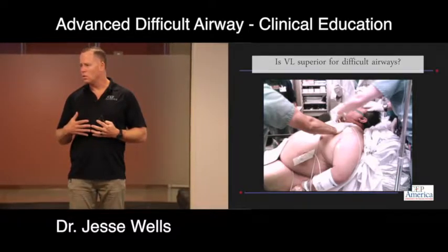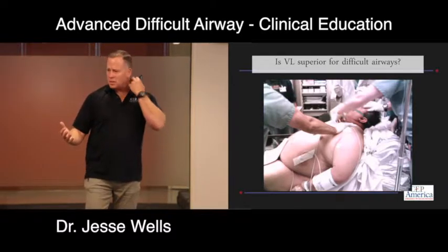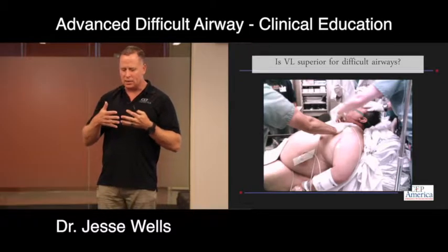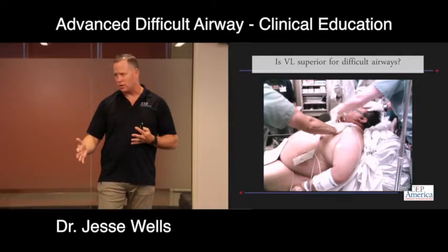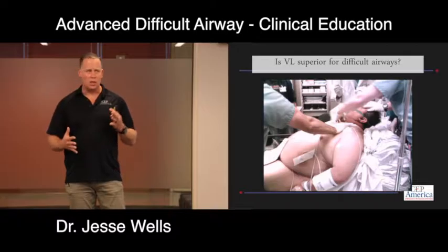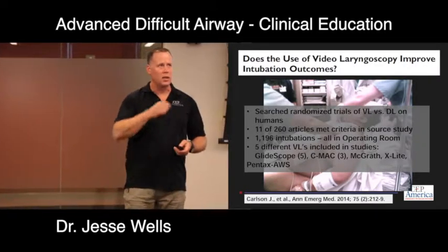What does it mean? It means that probably when they did the study, the people using the video weren't fast at what they had. Right. So what this means is that if you can't intubate somebody as quickly with the video as you can with direct laryngoscopy, then you want to use whatever you're faster with. And depending on our experience level and how we're trained, there's going to be a difference. And we'll talk about this study now, the novice versus the expert study.